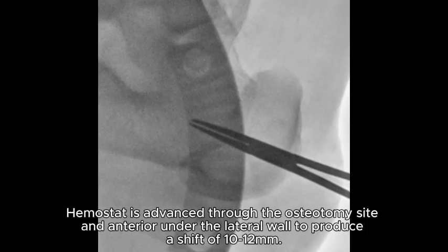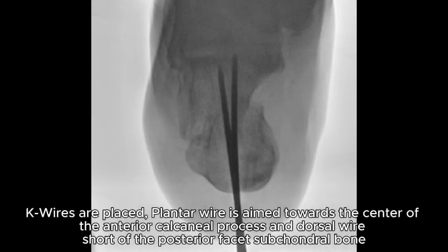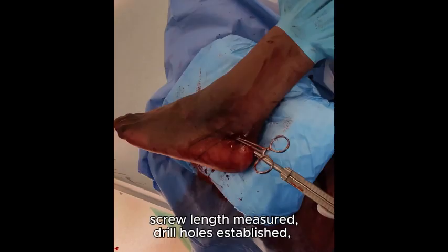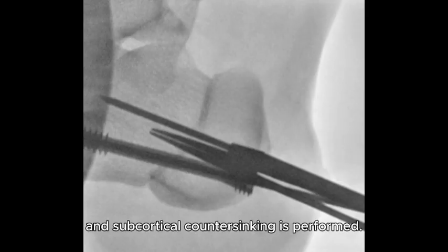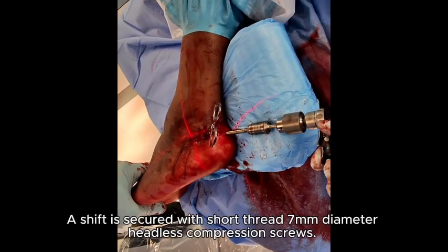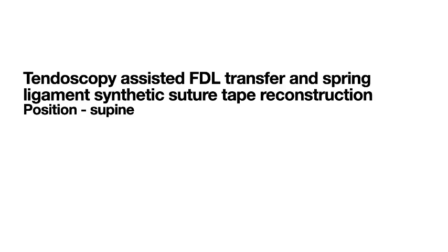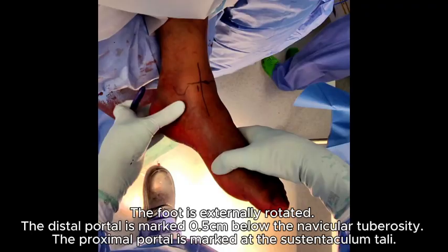12 mm. K-wires are placed, plantar wires aimed towards the center of the anterior calcaneal process and dorsal wires short of the posterior facet subchondral bone. Screw length is measured, drill holes established, subchondral countersinking is performed. A shift is secured with short thread 7 mm diameter headless compression screws. Follow with tendoscopy-assisted FDL tendon transfer and spring ligament synthetic suture tape reconstruction.